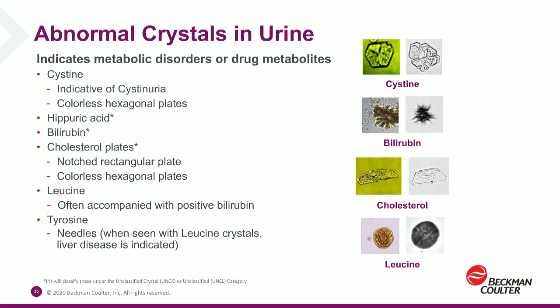Most people with cystinuria have recurring stones. Cystinuria is an inherited disorder. It is a lifelong condition that can be controlled but not cured. Crystals of the amino acids leucine and tyrosine are very rarely seen in a urinary sediment. These crystals can be observed in some hereditary diseases like tyrosinosis and maple syrup disease.